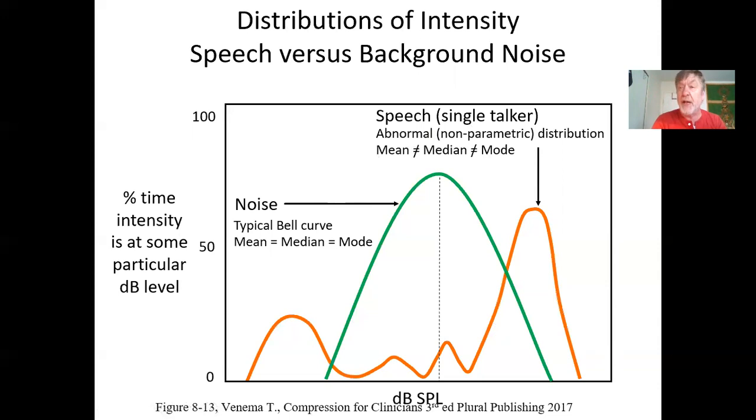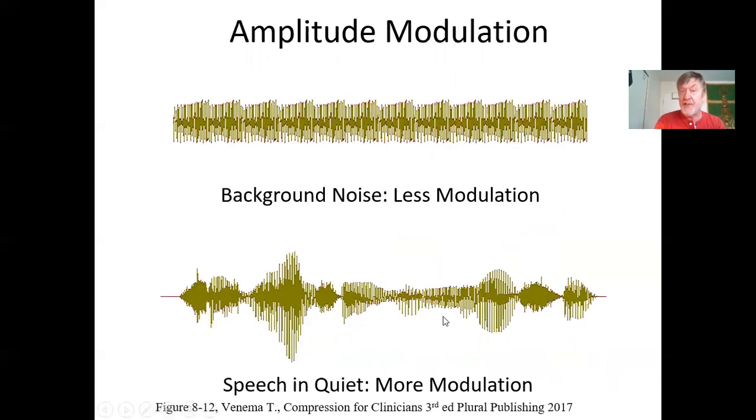And that, by the way, BTW, is how digital hearing aids sample whether the incoming sound is noise or speech. Does it fluctuate like crazy in amplitude over time? It must be speech. Amplify the crap out of it. Is the amplitude staying pretty steady over time? It's probably noise. Reduce the gain. You learned about that a bit in 240, and here it is again.